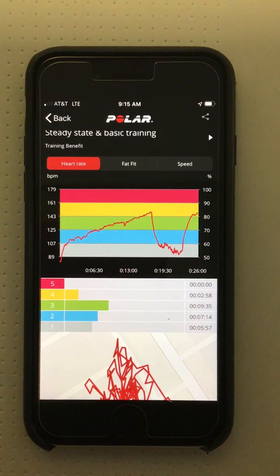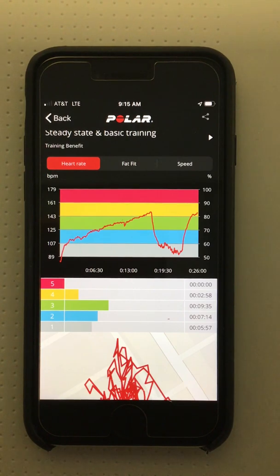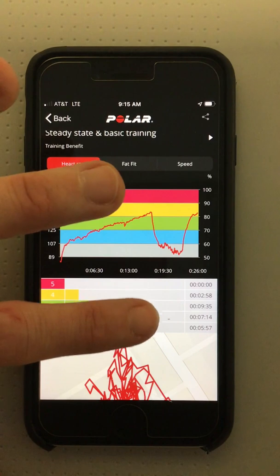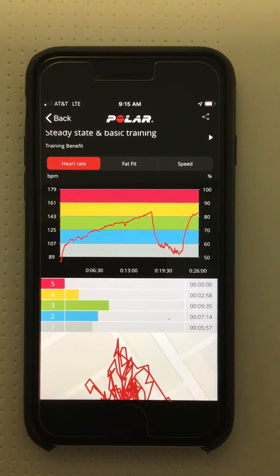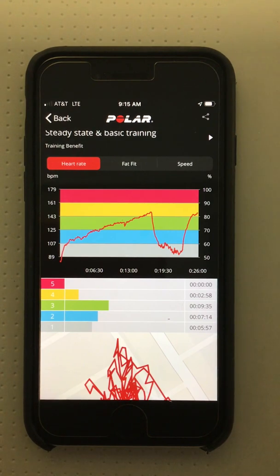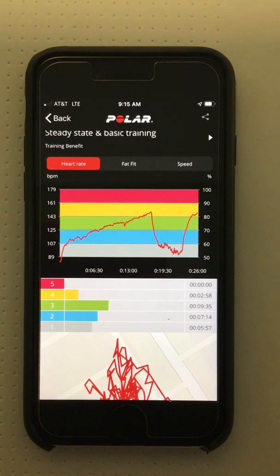The blue bar indicates the amount of time in the moderate intensity zone, or 60 to 70% of heart rate max — this patient spent about seven minutes and 14 seconds there. The green bar indicates the amount of time in the high intensity zone, or 70 to 80% of heart rate max, which is the heart rate zone we're targeting. This patient spent nine minutes and 35 seconds there.